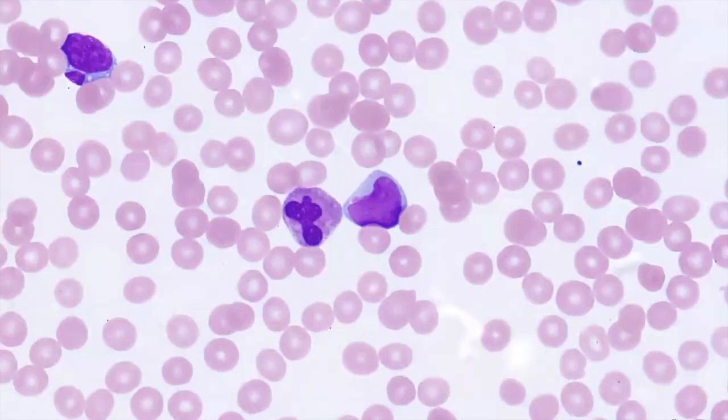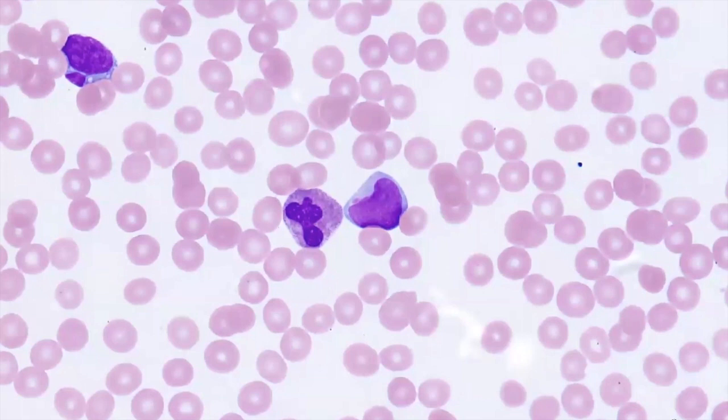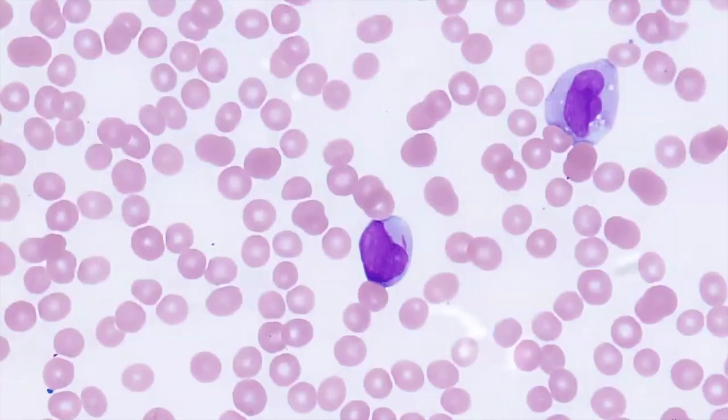If you find that the blasts are granulated with more abundant cytoplasm, you may be more suspicious that this is an acute myeloid leukemia as opposed to acute lymphoblastic leukemia. Additionally, if you see Auer rod inclusions, you may definitively call this a myeloid lineage cell. Here's another good example of an Auer rod inclusion, confirming our suspicion that this is likely an acute myeloid leukemia.